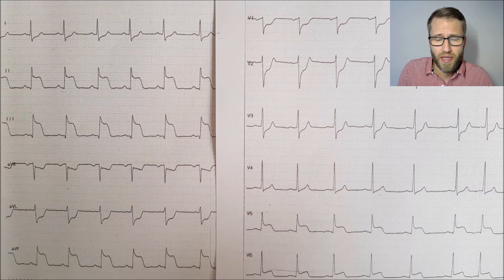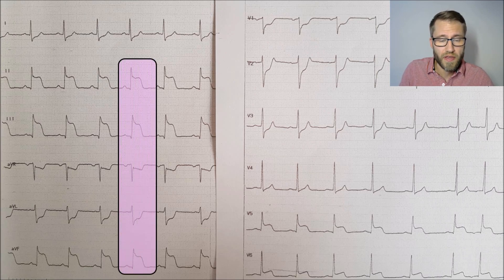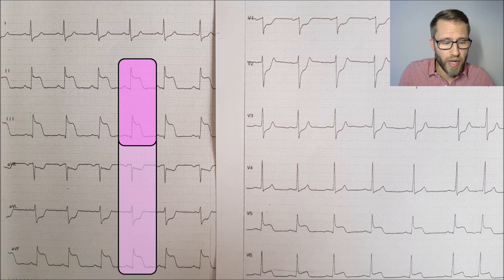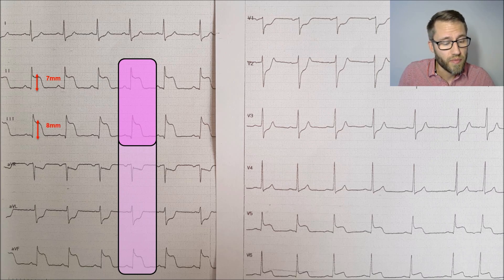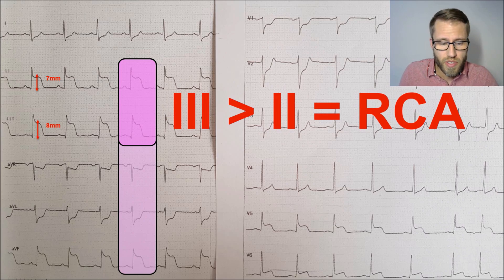There is a way I want to show you — it's not always right, but it gives you a better chance of choosing the correct culprit vessel. Have a look at the inferior limb leads and especially at lead 2 and lead 3. What we want to do is measure the size of the ST elevation in leads 2 and 3. In this example, you have an ST elevation of 7 mm in lead 2 and 8 mm in lead 3.